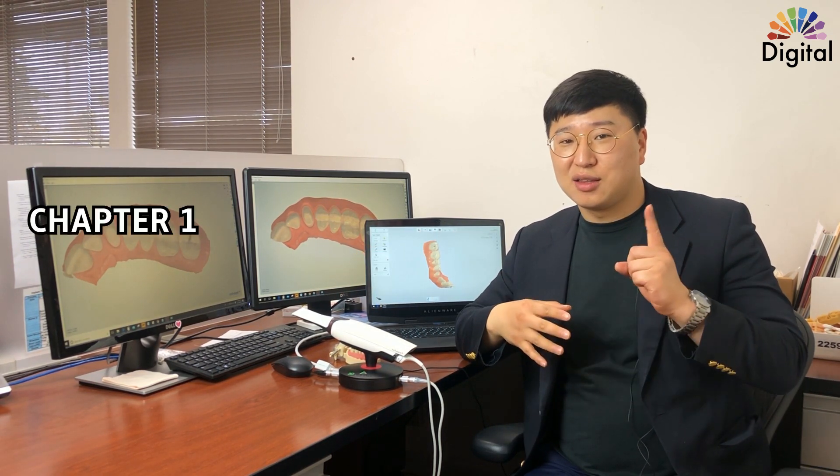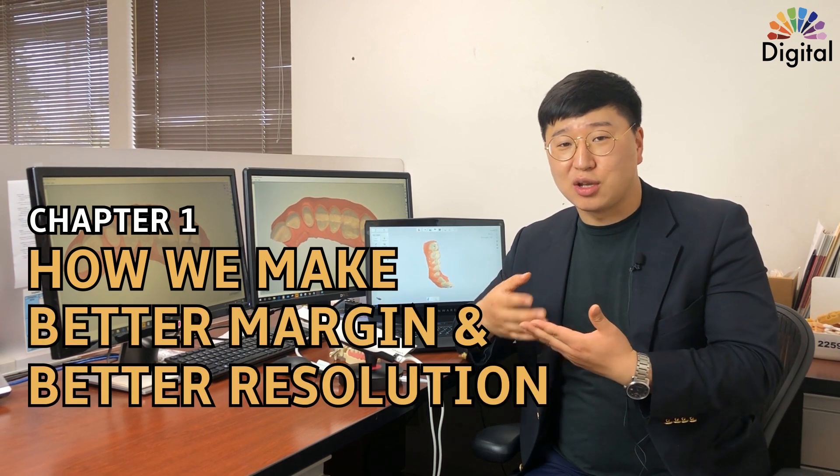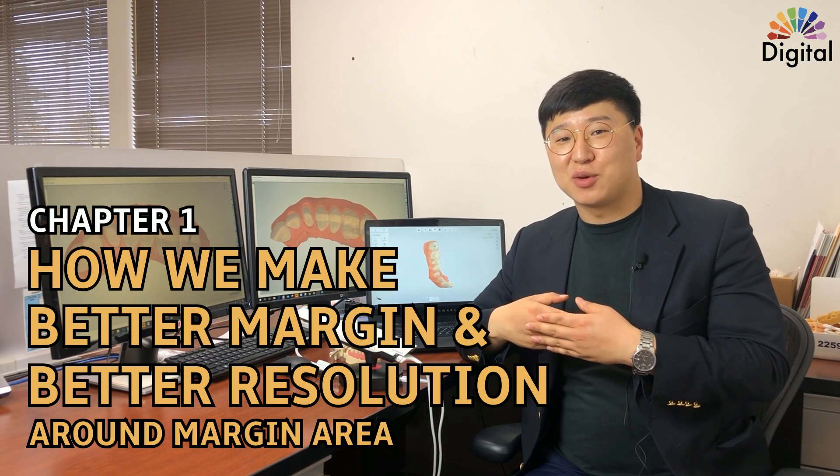Today I just want to show you the tips for the TRIOS scanner functions. It's good for doctors, good for your technicians, and also good for your patients at the end. I have three different scan files here with some small tips and secrets to make them better. We're going to make five to seven videos for the TRIOS software functions, and today is chapter one — how to make a better margin and better resolution around the margin area. Let's get into TRIOS software with Jack.